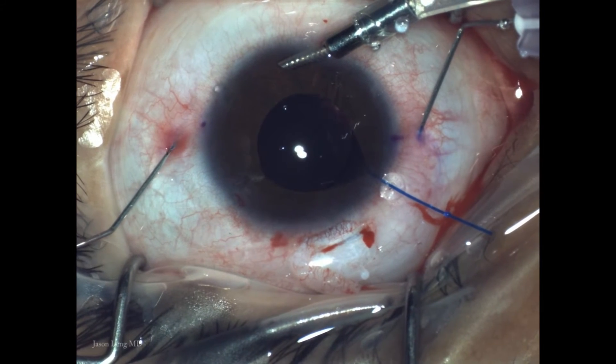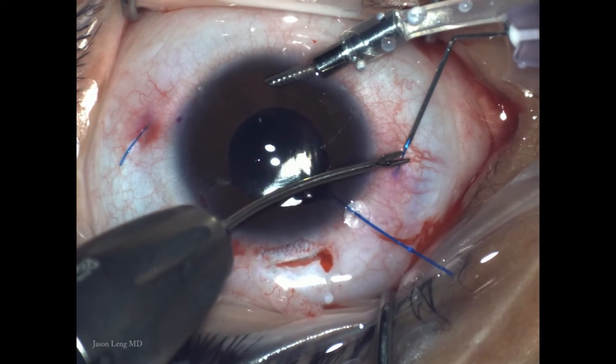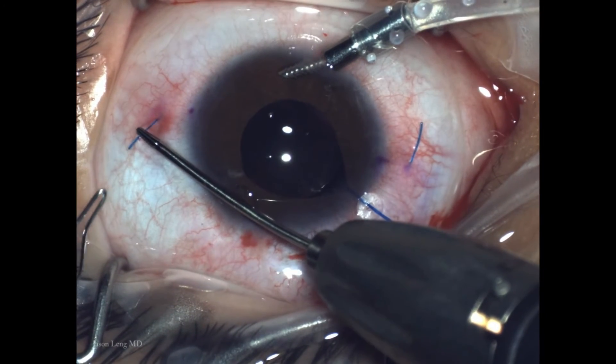Now I'm externalizing both haptics simultaneously and the lens is rotating counter-clockwise. The haptics are quite snug, and even in cases where I use a 27-gauge needle it is still pretty tight.